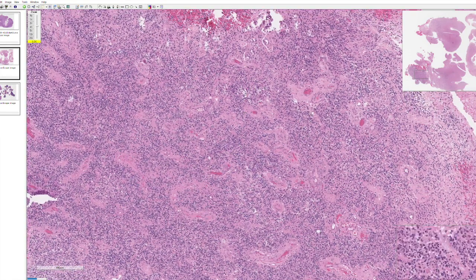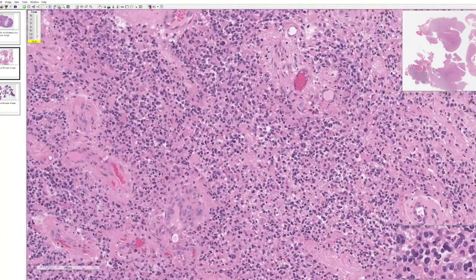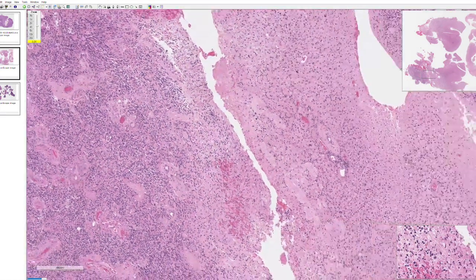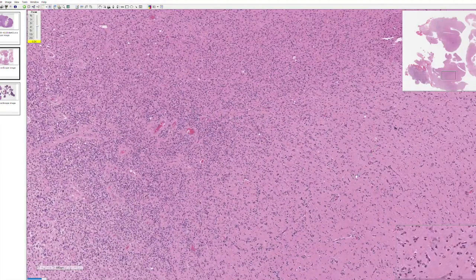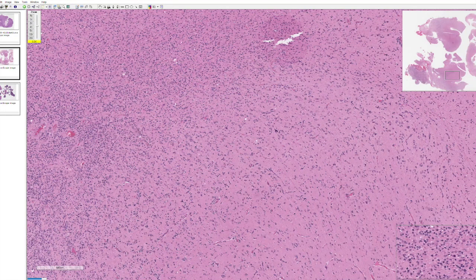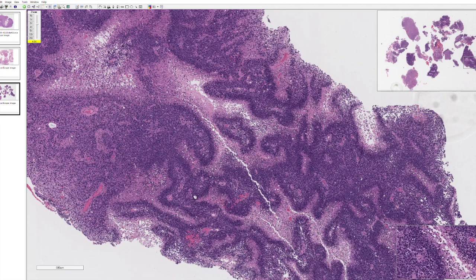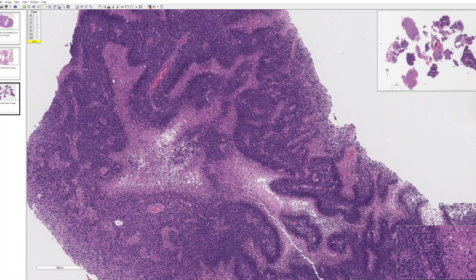Again, we have hypercellularity, we have atypical cells that are undergoing rapid cell division, we have microvascular proliferation, we have infiltration into nearby normal brain that makes it difficult to resect, and of course we have these pseudopalisading areas of necrosis where there are hypoxic areas of the tumor that perhaps could provide some resistance to conventional therapies.